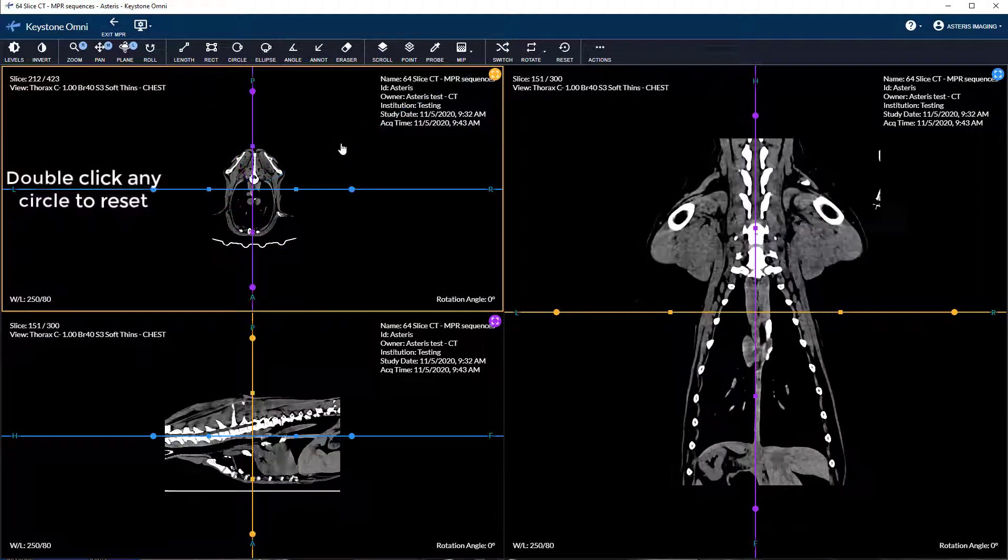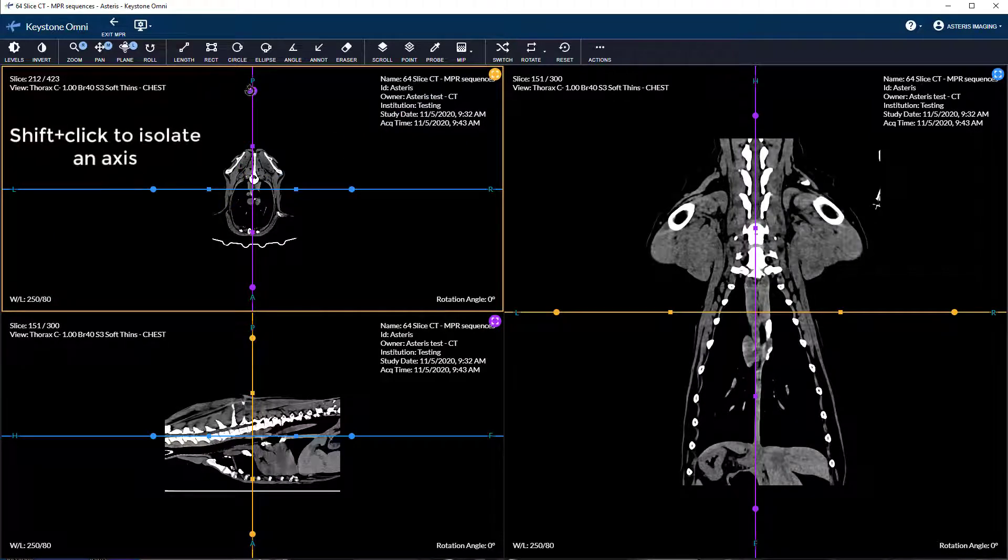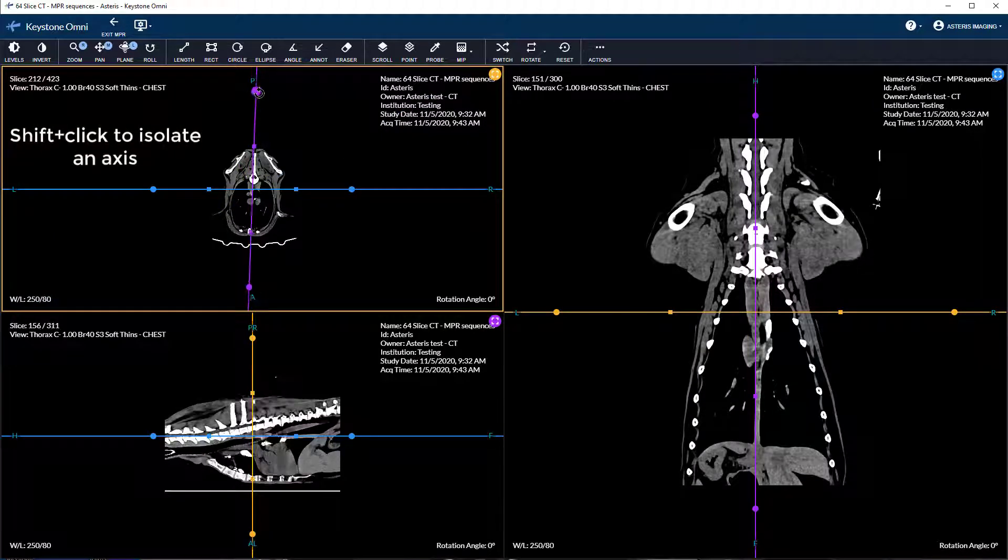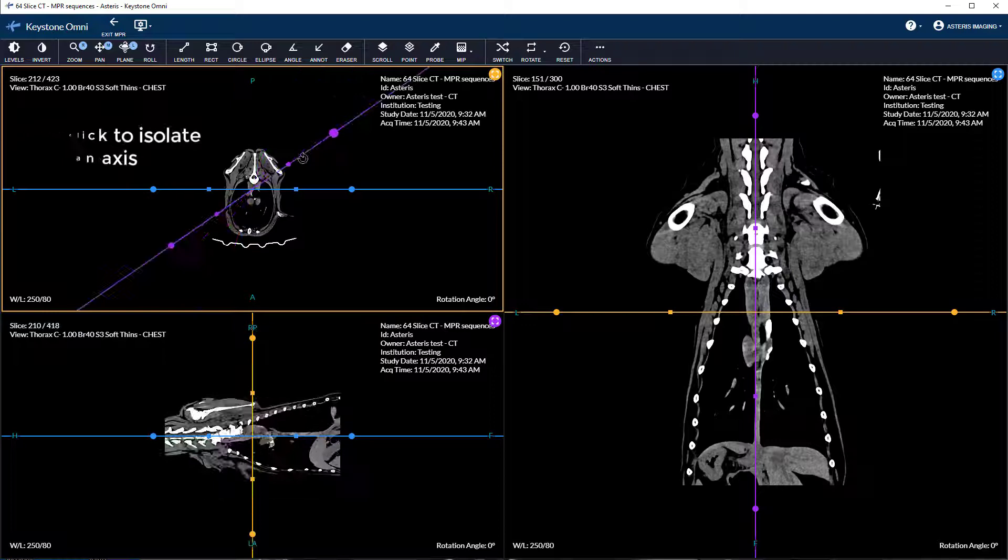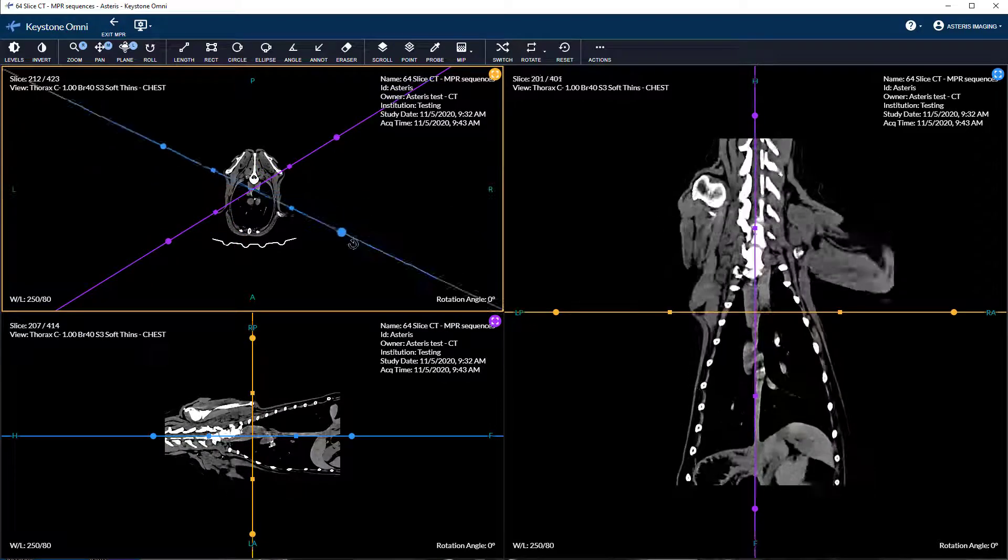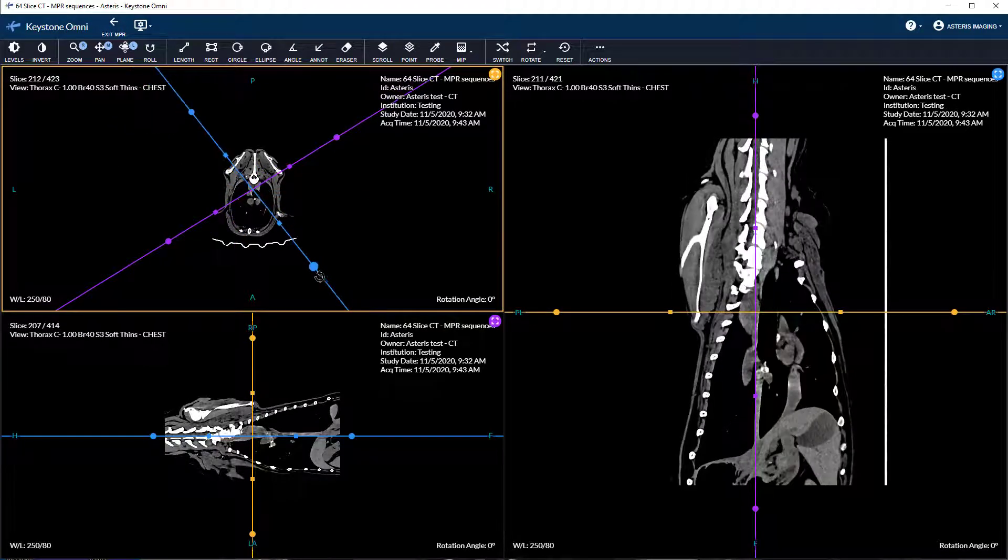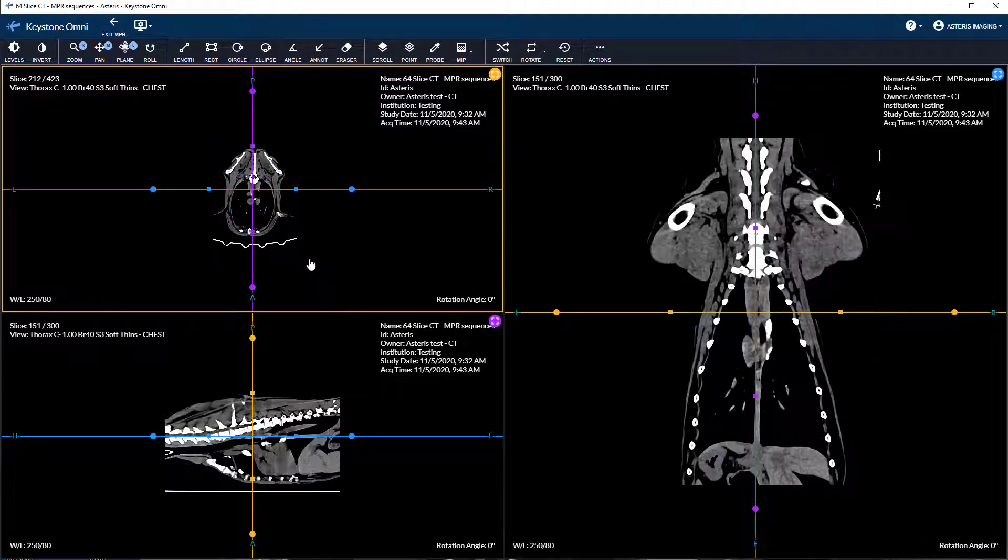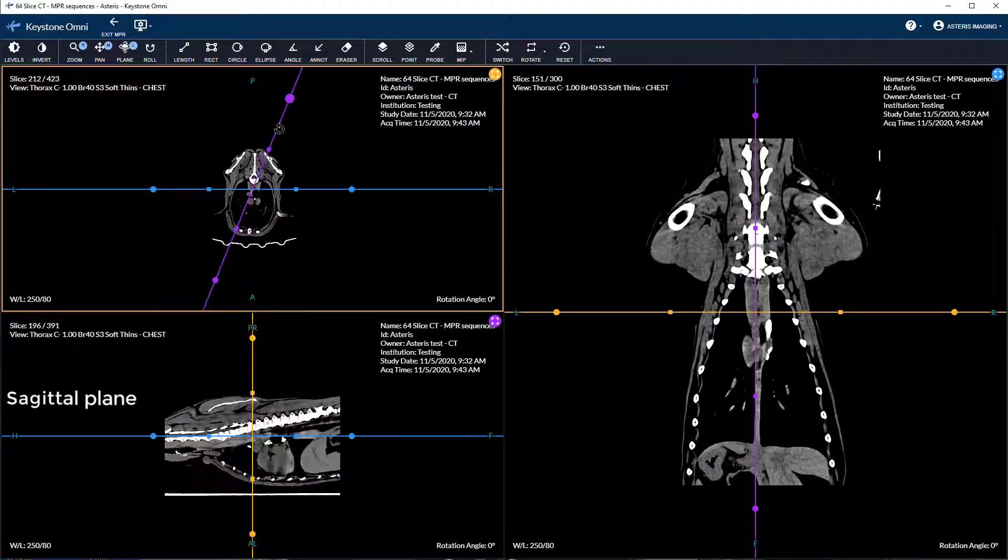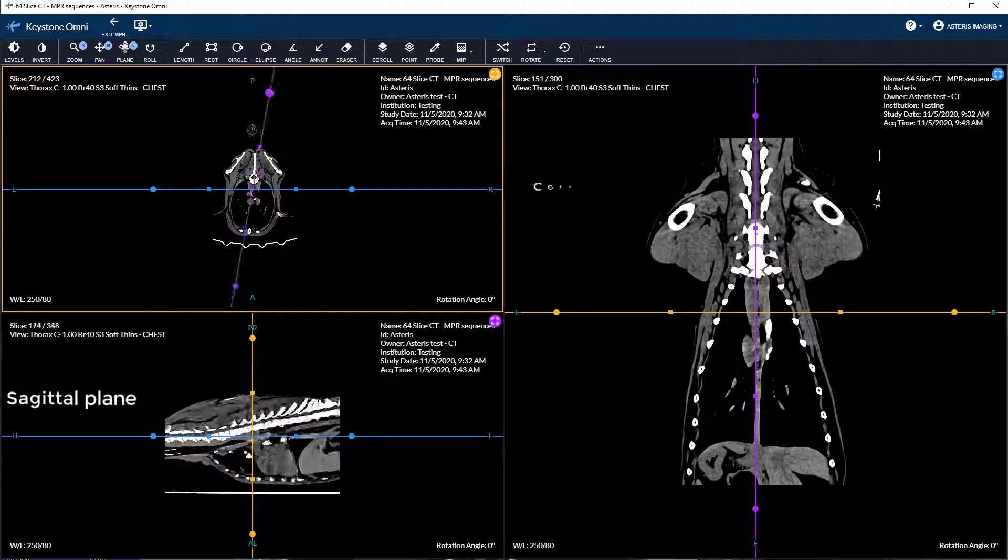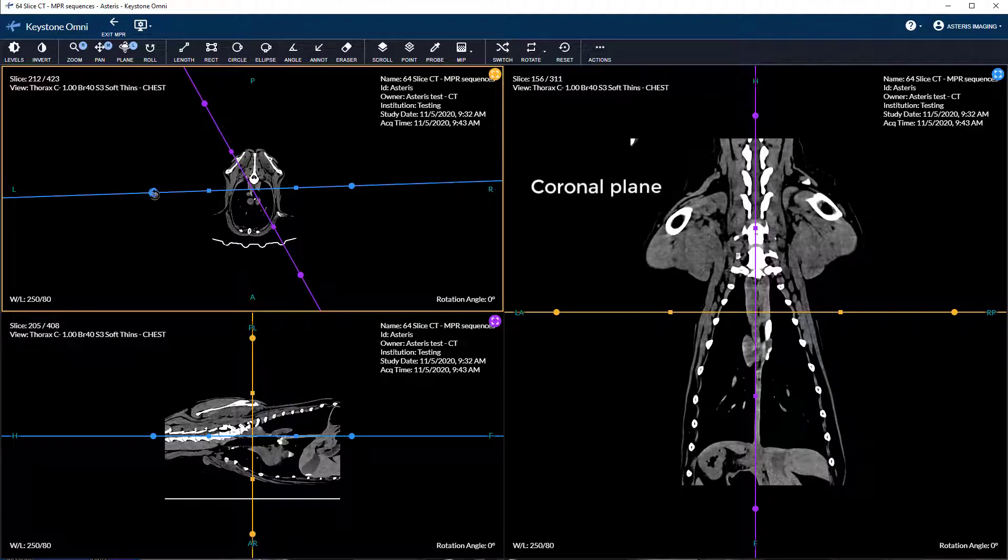If you want to isolate rotation to a single plane, shift plus drag the color coded circle to rotate the desired axis. If you want to rotate the sagittal image, shift plus click the purple circle. For the coronal, shift click the blue circle.